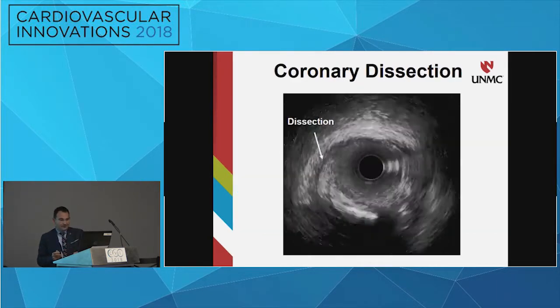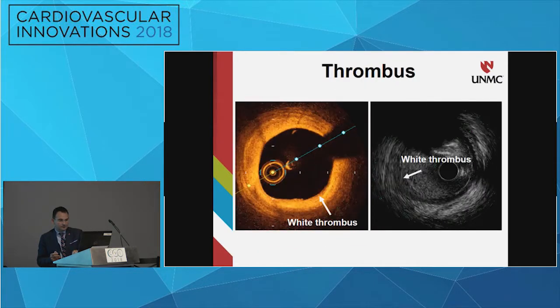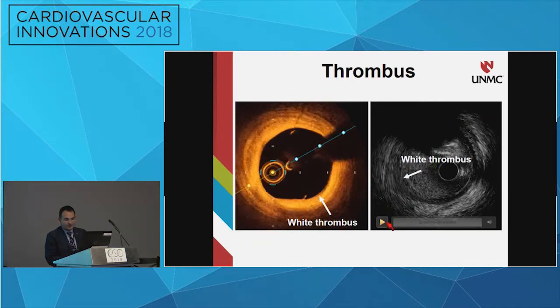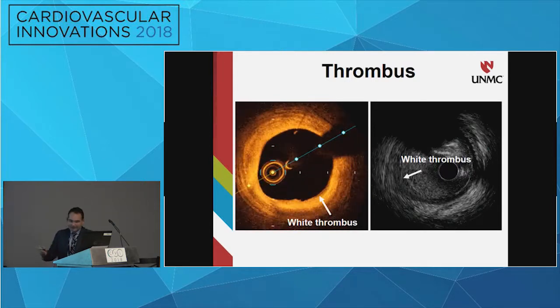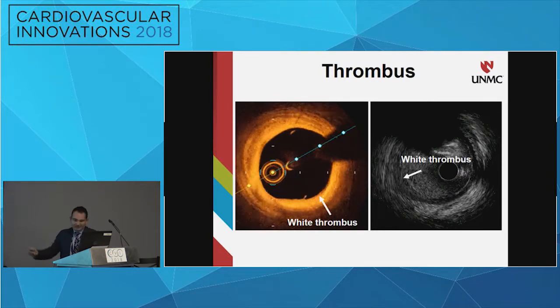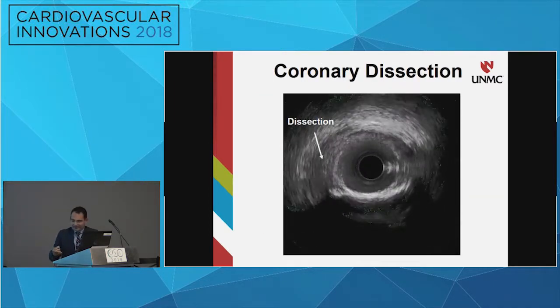Let's see if the OCT can see it, if we're lucky enough. Oh, come on, this video has to play. This is the only video that I would love to have here. So it was there. It was there with this high resolution imaging and with IVUS. And if you don't believe me, I can show this to you later on.